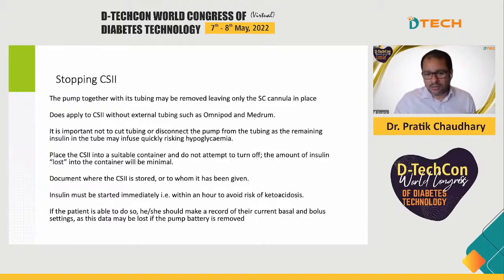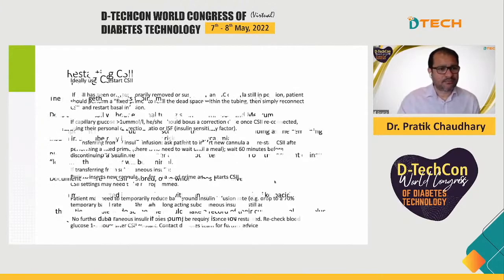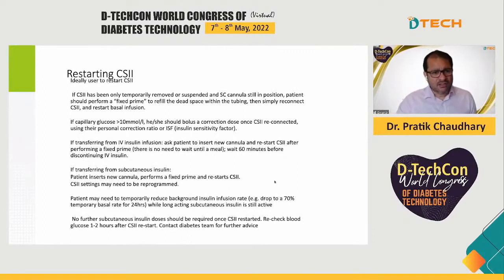Again, when you're putting a pump on, be careful. Make sure you have an overlap between IV insulin and the start of the pump of at least an hour, because the pump is delivering insulin subcut and it takes a while for it to pick up. And make sure any patient going in for a procedure has a clear record of their settings, because they may be lost if the pump battery is removed. If the pump is beeping and alarming, someone might take the battery out and lose that. So the pump has been removed.